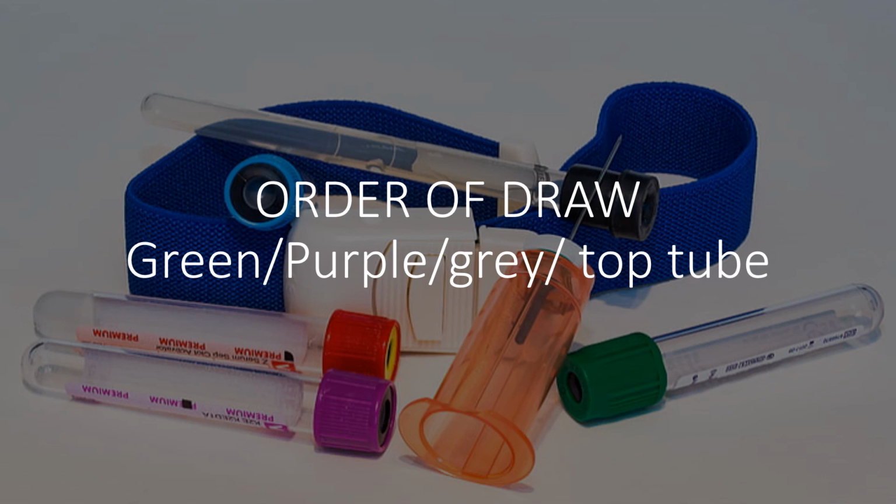And so remember, our green top tube is for chemistry profile, so we're going to take it to the chemistry department in the lab. Our purple top tube is mainly for our hematology studies like CBCs, hemoglobins, hematocrits, platelets. And it would be taken to the hematology section of our lab. But it can also be used for a hemoglobin A1C testing, which has to do with your glucose in your patient, and we'll go over that test.